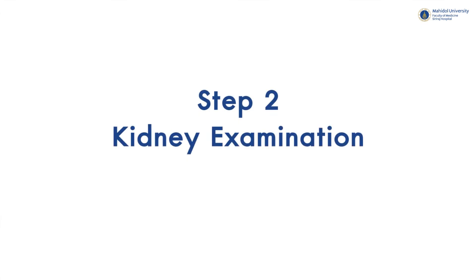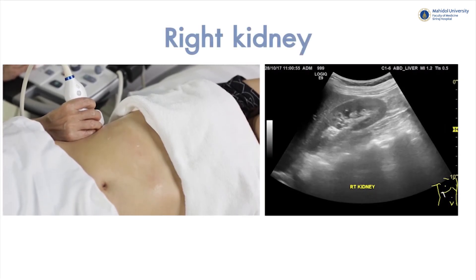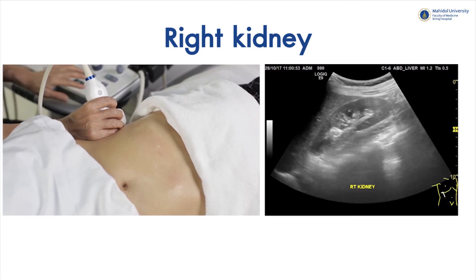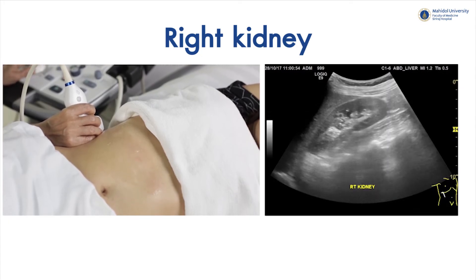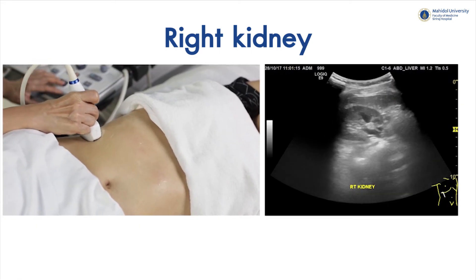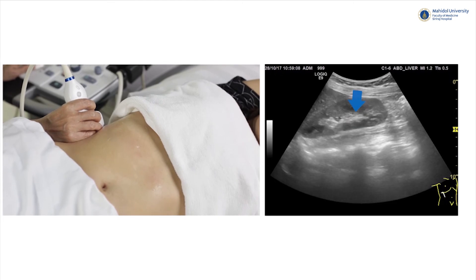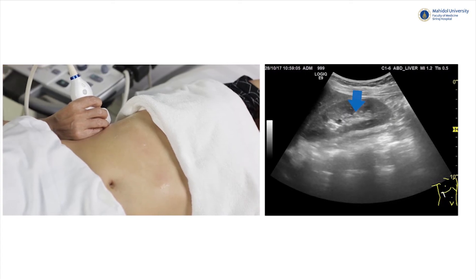Step 2: Kidney examination. The right kidney locates below the right hepatic lobe. To examine the right kidney, place the patient in right-side-up position or left lateral decubitus. To measure the size of the kidney, measure its maximal length. Normal right kidney should have lower parenchymal echo than that of the liver. The central hyperechoic area within the kidney is called the central echo complex, which contains renal sinus fat and the pelvicalyceal system.